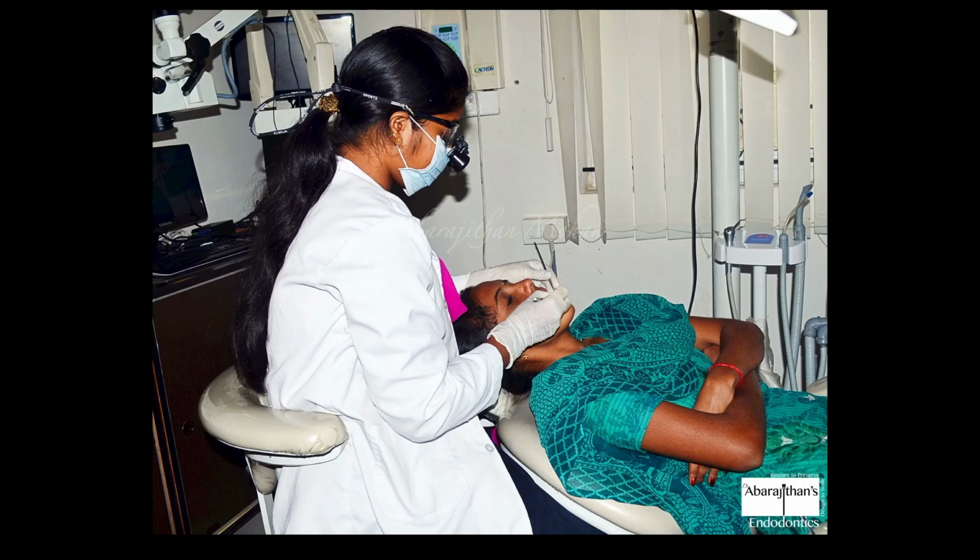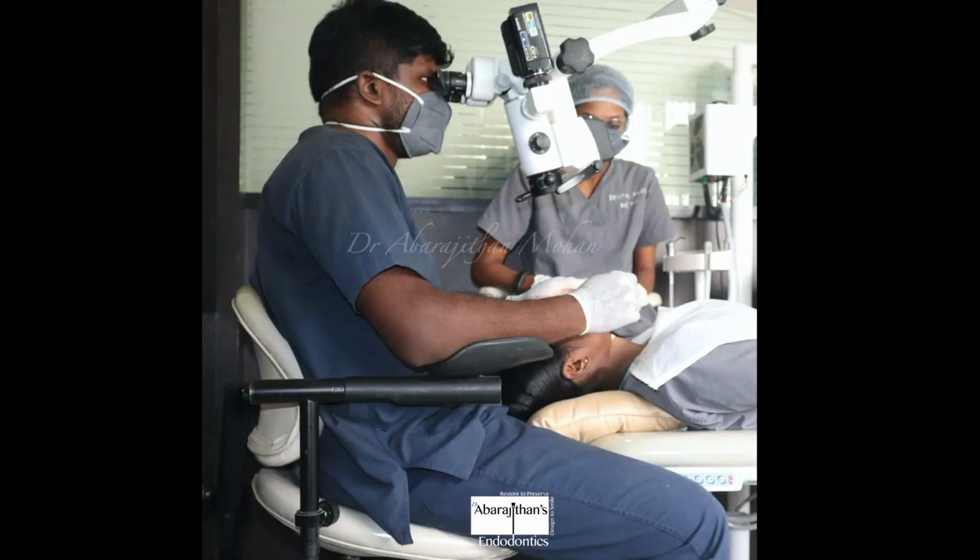So what happens when we use magnification? You can see in this picture, when the doctor is using loupes for magnification, automatically her head moves away from the work, but still you can see that there is some amount of bending of the back and the neck, but still it's far better compared to working with the naked eye. And here is a picture of me working with a microscope, and you can see that both the back and the neck are erect. So this is the biggest advantage of the microscope.